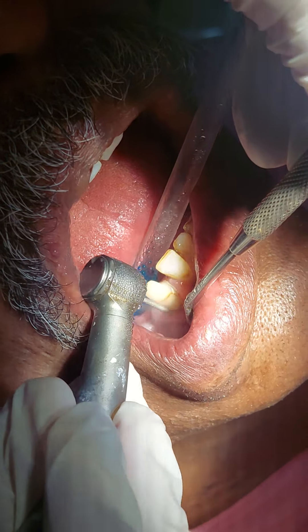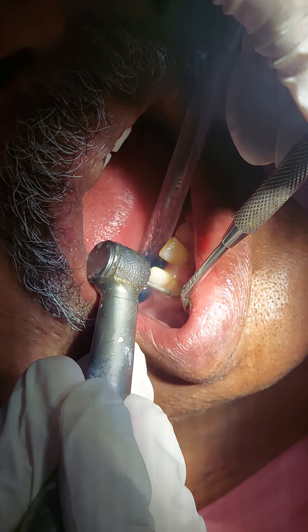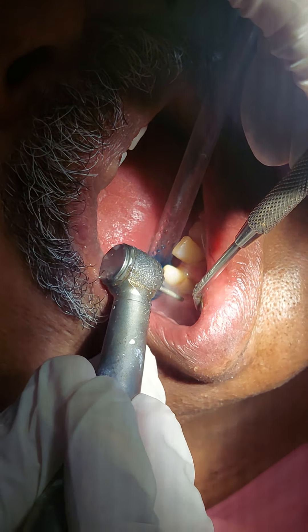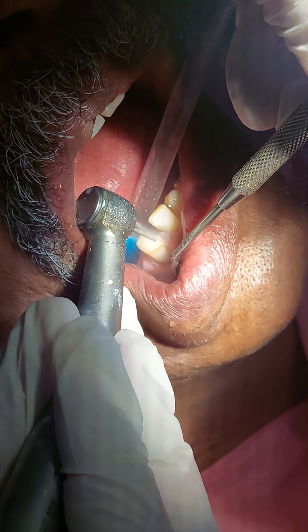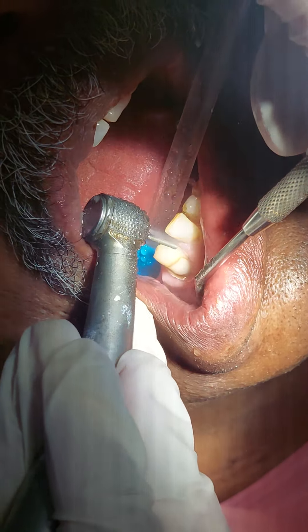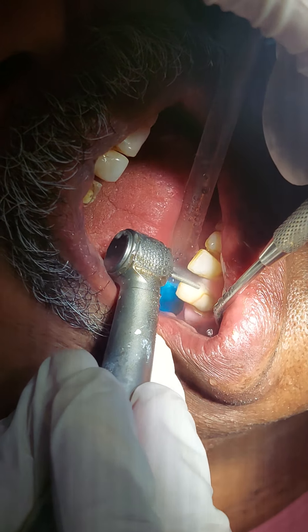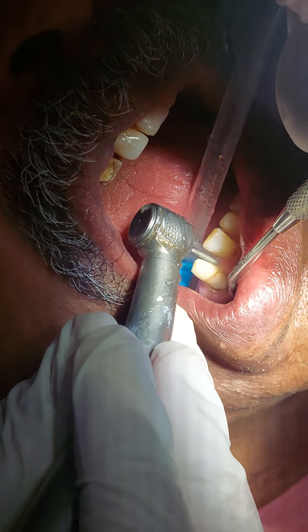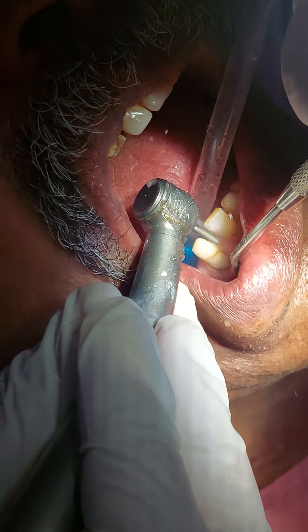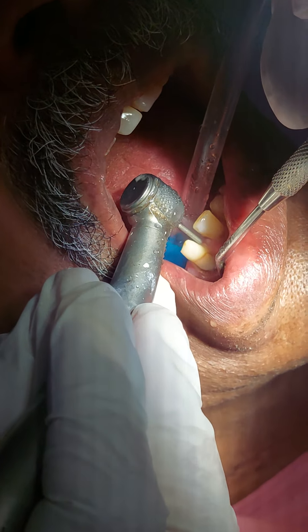The bur is working, but not always when the bur is working do you have to be on the tooth. You can still be planning — I could use the orientation of the bur to plan first, even before touching the tooth. The bur is working but I'm just lightly touching to check the undercuts. Going closely to the tooth — there is no undercut here. Notice that the head of the bur is over the center of the tooth, so this is the correct orientation.